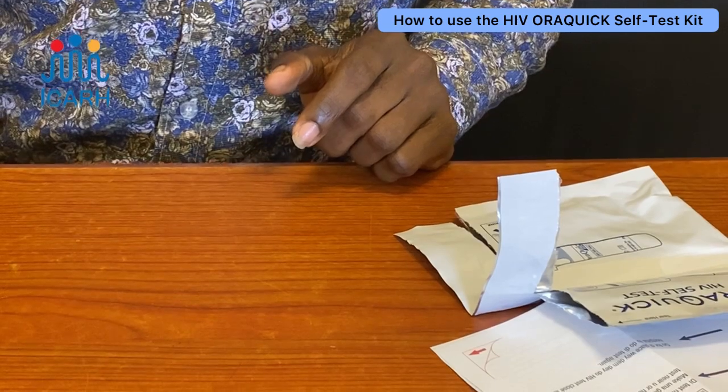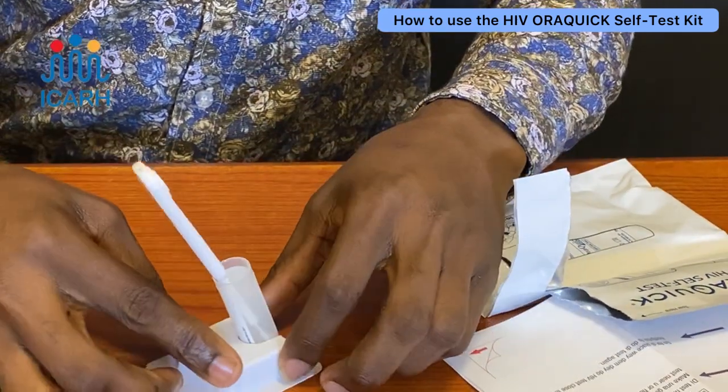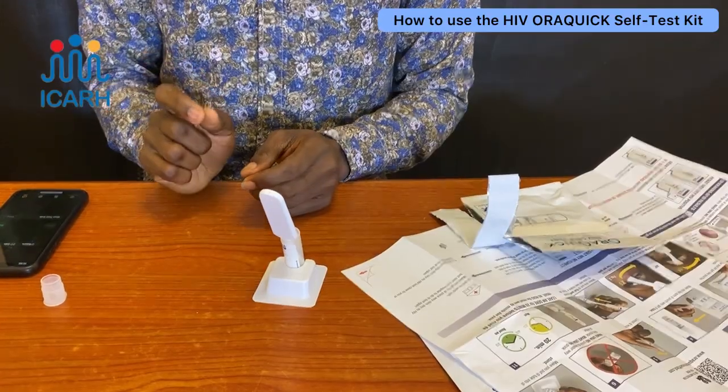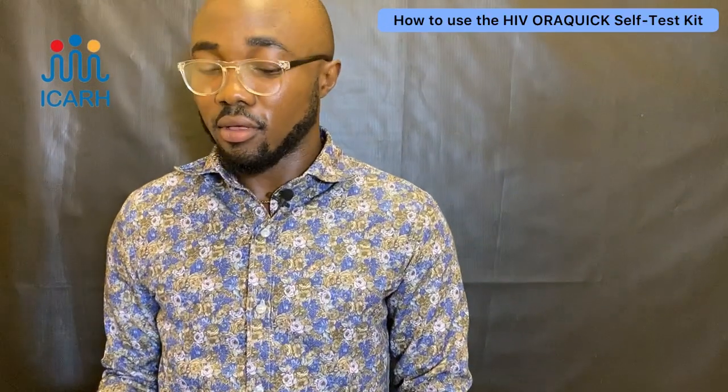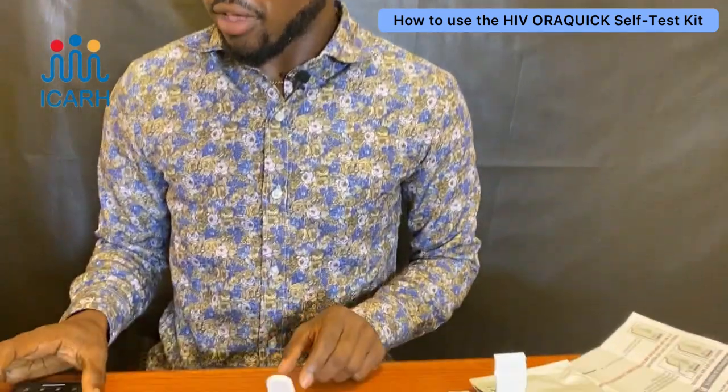Place the test kit in the buffer, then set your timer for 20 minutes as mentioned earlier. Once you drop the test kit into the buffer and set your timer, wait for 20 minutes to read the results.